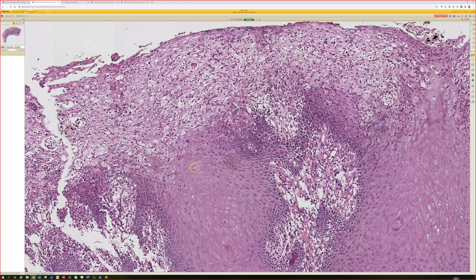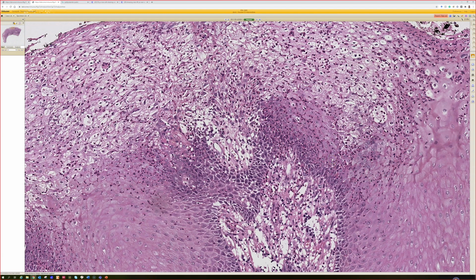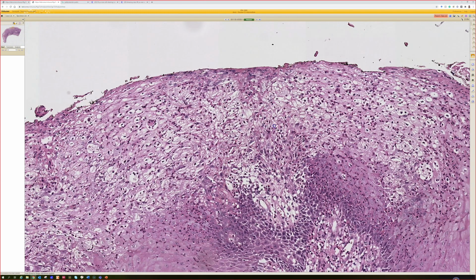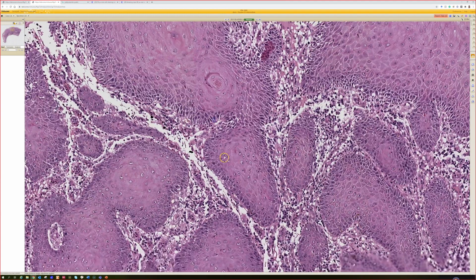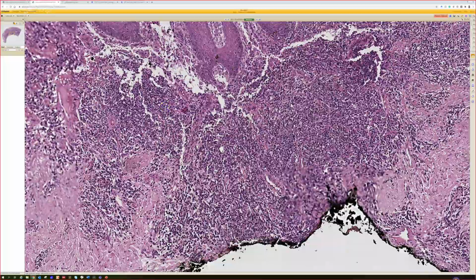So what do you think then? That's an excellent description and a very nuanced and subtle thing you picked up on. Regularly when we think of PEH, pseudoepitheliomatous reactive epidermal hyperplasia with neutrophil aggregates with pus, we think of deep fungal and stuff like that, right? Bromoderma, iododerma, halogenodermas. And we expect the neutrophils to be down in the dermis, kind of in pockets underneath the PEH. But here we see a whole bunch of edema and epidermis falling apart and keratinocytes kind of ballooning and getting real pale and swollen and tons of neutrophils. Then we see the pseudoepitheliomatous hyperplasia. And then down here, like you said, we see a dense infiltrate of plasma cells and lymphocytes.